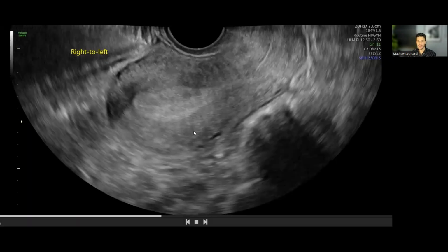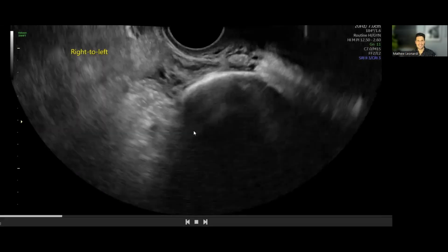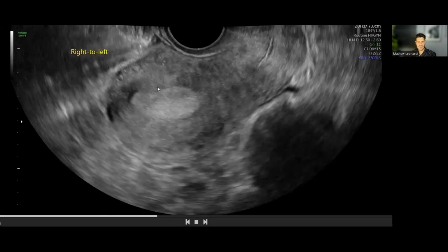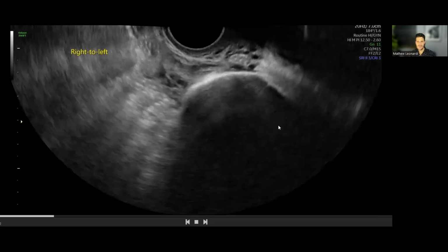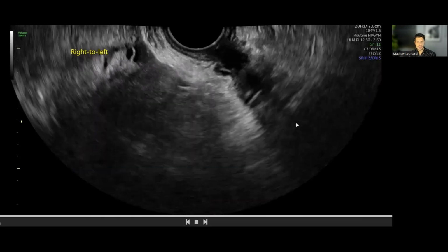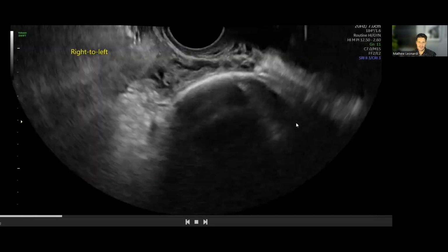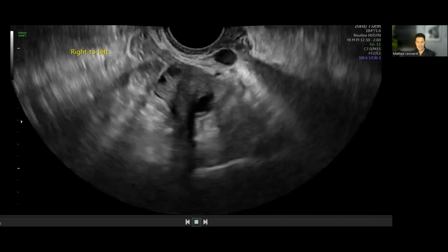All right, moving on to the uterus. And my sonographers know that the cine is where the magic happens. So we're starting off with a right to left cine of the uterus, right side to the left side. And so far it's played a couple times. So maybe some of you have already seen the pathology. Obviously, a little bit of a spoiler at the beginning of the video around which pathology we're going to be focusing a little bit on today. So let's get into it.